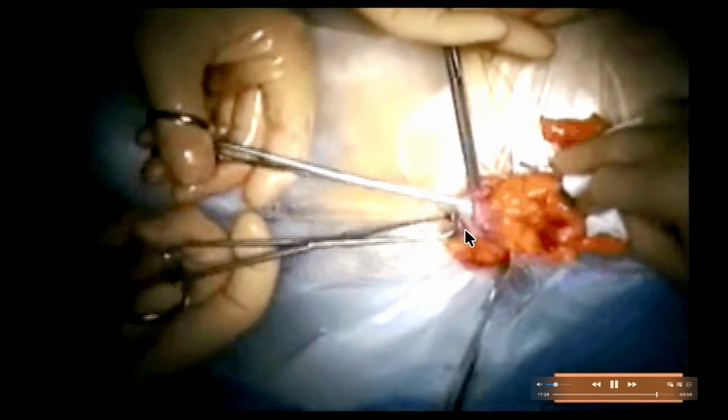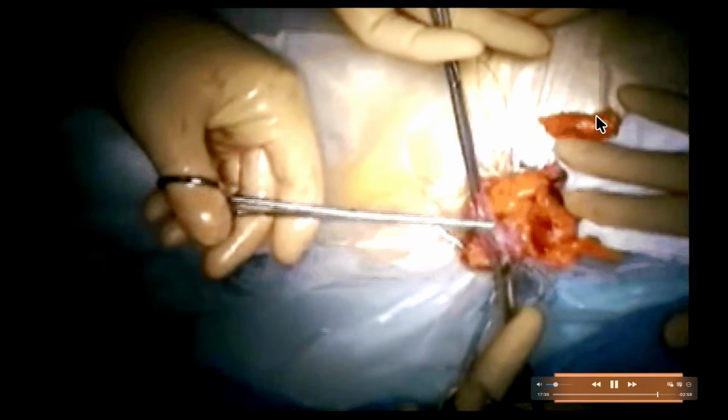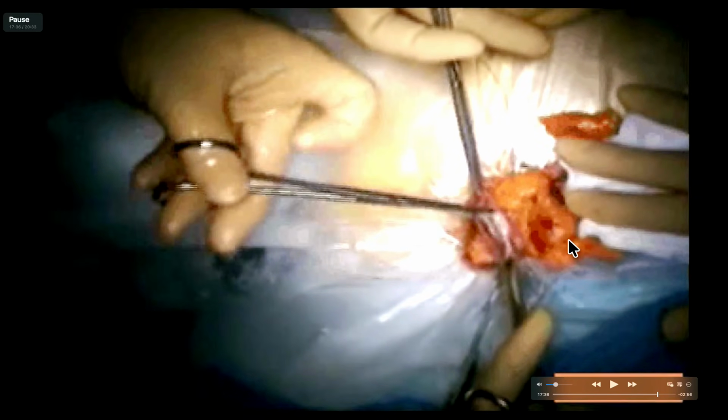And now the purse string is already applied. Now this purse string you will open, and you will drop the anvil into that. This is all over the wound protector, and this is the laparotomy wound. At that time, when you are taking the colon out, cutting the sigmoid out, and putting the anvil, there is no pneumoperitoneum, the laparoscope is out, all the instruments are out, only the cannula is there. And it is the open part of the surgery.